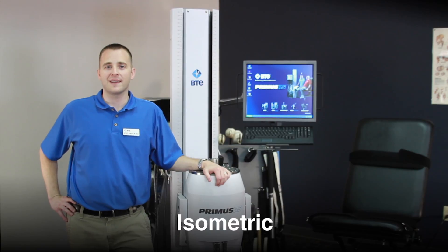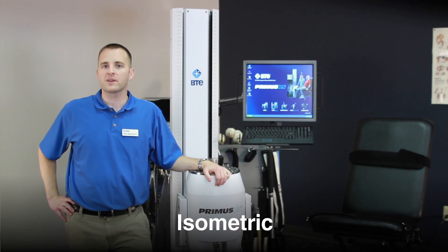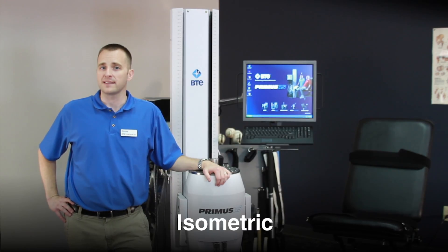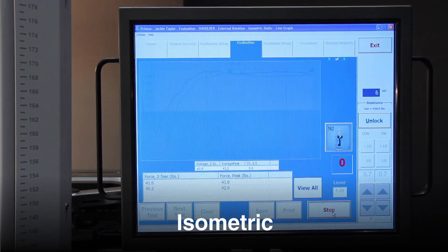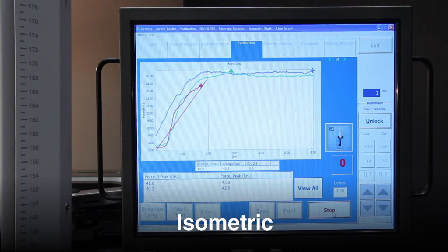Primus also provides isometric resistance, another common resistance type we encounter in everyday life. The isometric mode is used for testing — key to measuring maximum strength capability and to determine appropriate resistance levels for dynamic rehab activities. Isometrics can also be used as a treatment application to provide sub-max strength training and feedback for neuromuscular re-education.